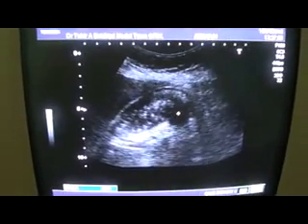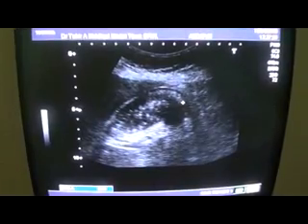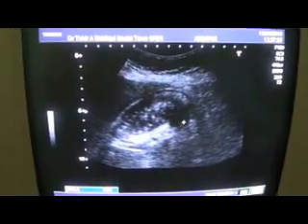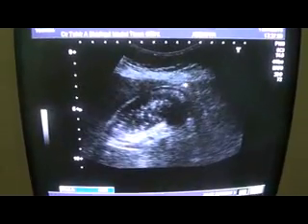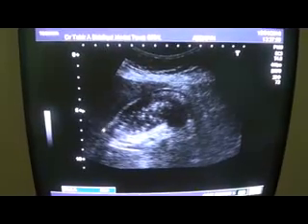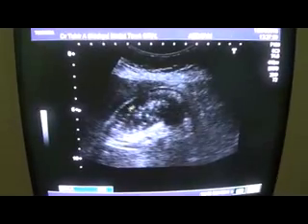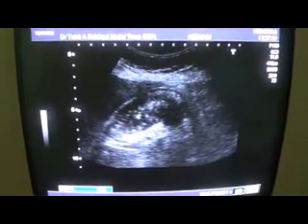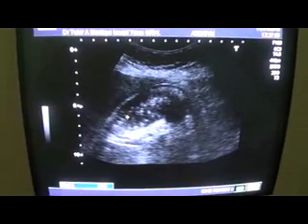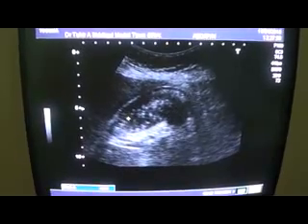We are seeing the gallbladder of a 60-year-old female presenting with severe epigastric pain. This is the fundus and this is the wall of the gallbladder. The lumen is filled with tiny particles and they all give posterior cometary artifacts or short reverberation artifacts.